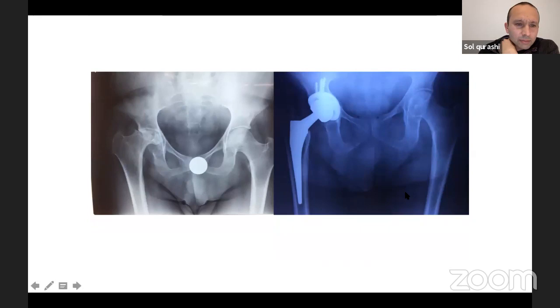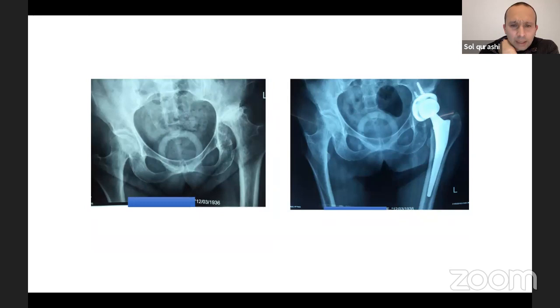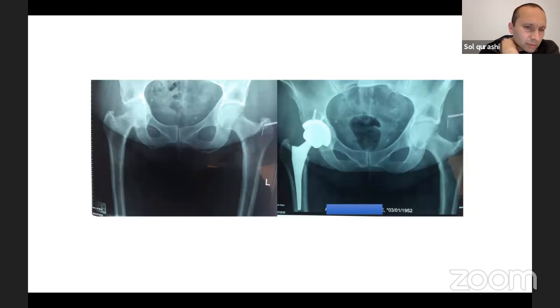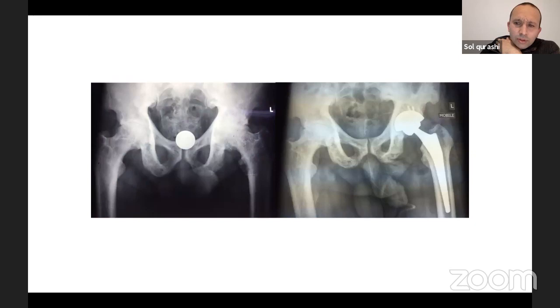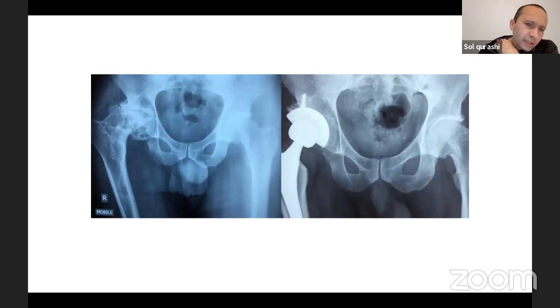Avascular necrosis, DDH and avascular necrosis. What's wrong with this person? Oh, this is just a little bit of protrusio, mild. This one's just got a lot of osteophytes and contracture. This one was osteopetrosis. AVN on a background of Perthes. This hip was almost ankylosed.